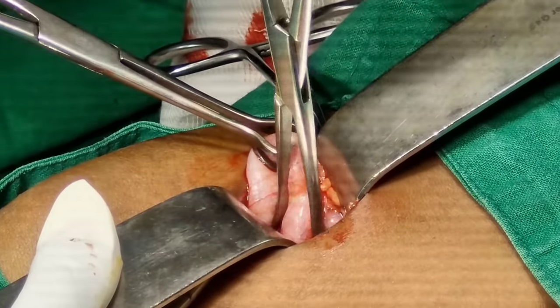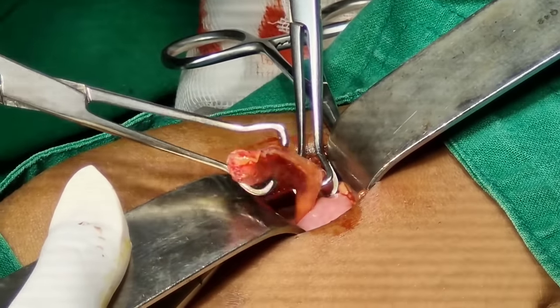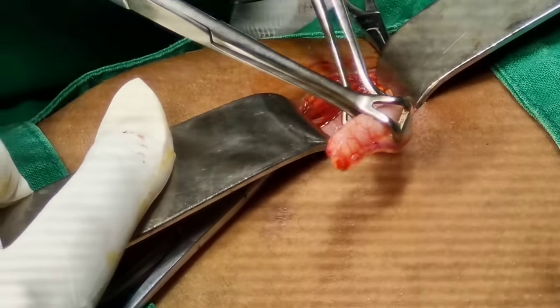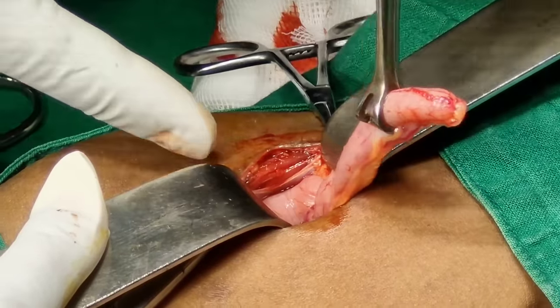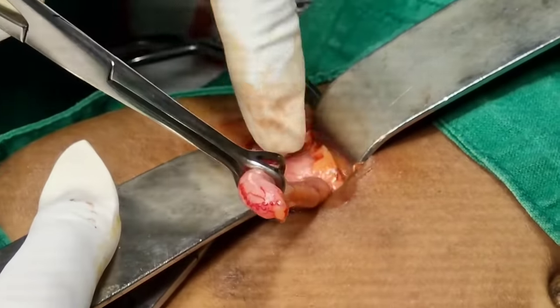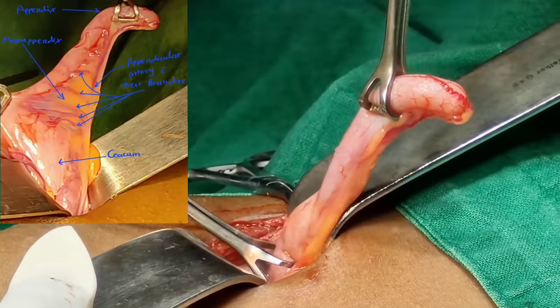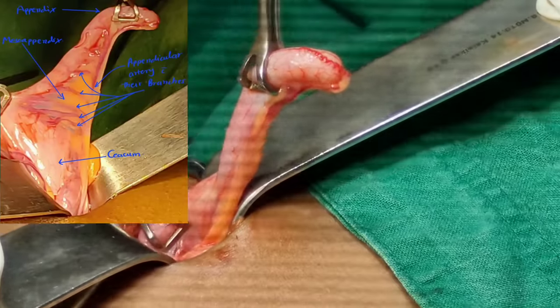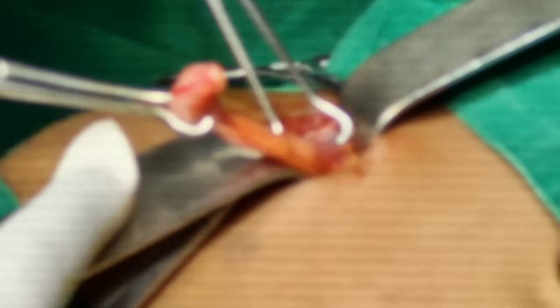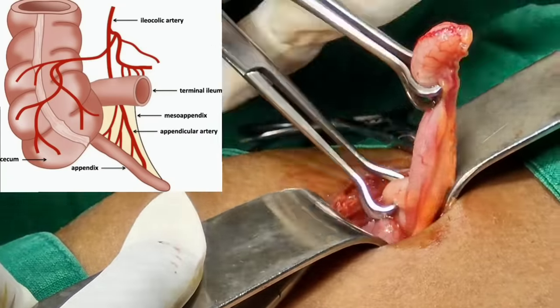And here is the appendix. The tip is inflamed. Now, hold it with Babcock at near the tip and with a second Babcock at near the base. After identification of the appendix, you have to separate it from the meso-appendix. Meso-appendix is a portion of mesentery. It extends till the tip of appendix, but in this case it is small. It contains the appendicular artery, vein, nerve, lymphatic vessels and lymph node. You have to separate it very carefully.